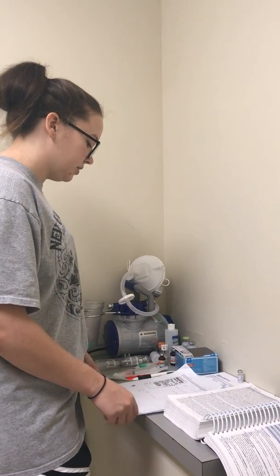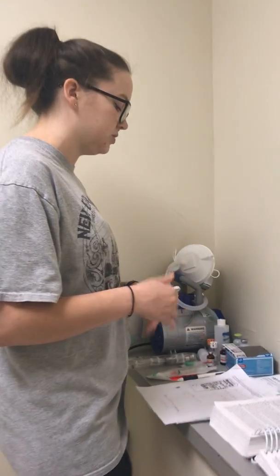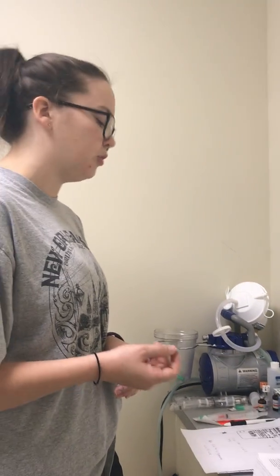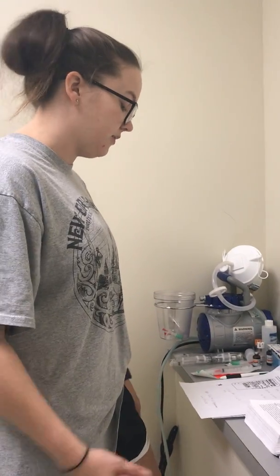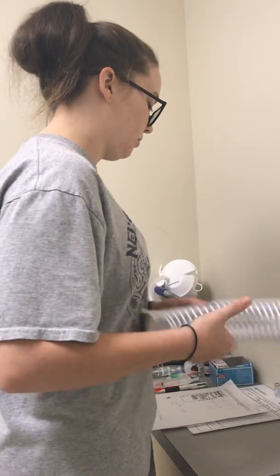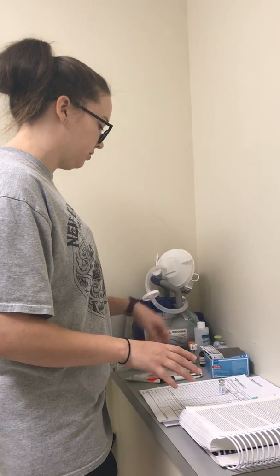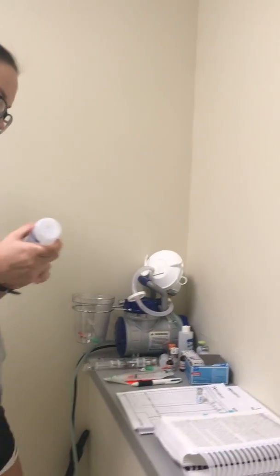So now, after I've done my math, I've gotten my volume. Since I'm going to choose to go over 5 minutes, my volume equals out to be 0.6 milliliters. So I would administer just about a little over 0.1 milliliters per minute, but approximately divided by 5, it's 0.12 milliliters. So now I'd start gathering all my equipment. Before I do that, I'm going to wash my hands.